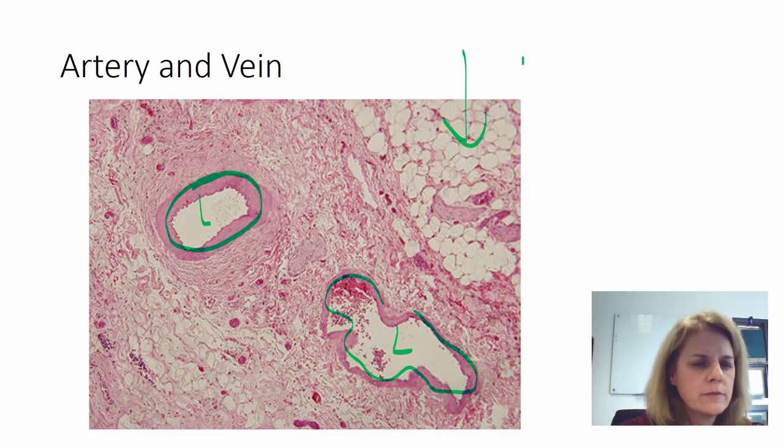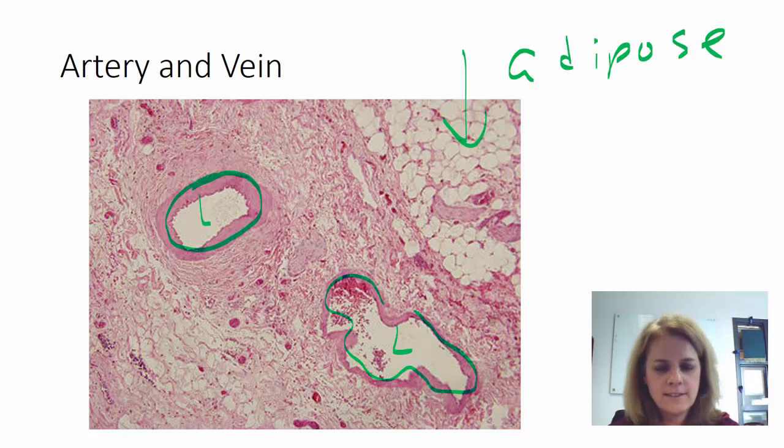This is adipose. It does kind of look like thyroid tissue, doesn't it? To me it does anyway.